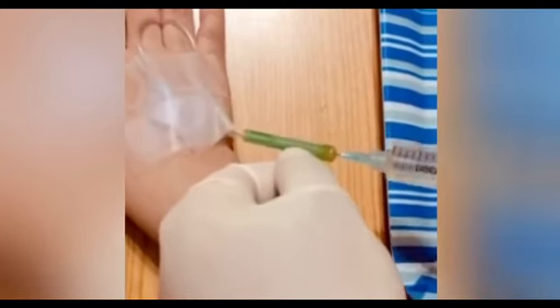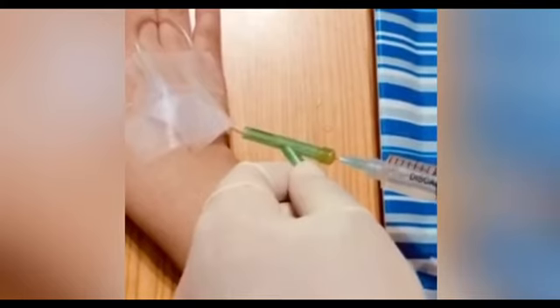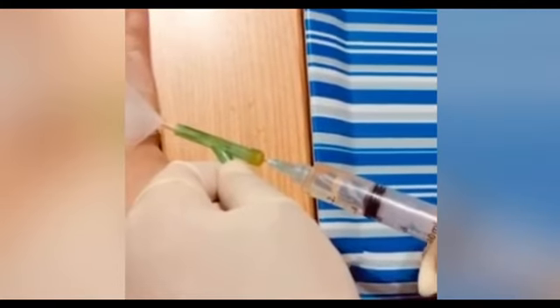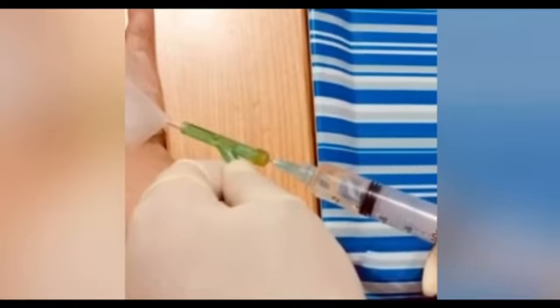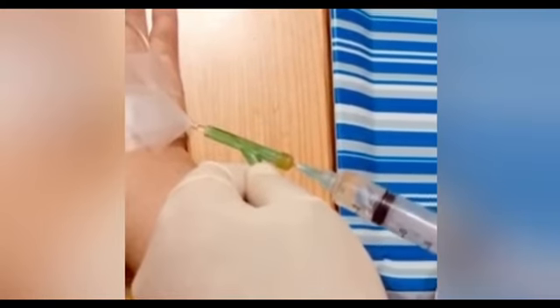So when flushing, we aspirate to check for backflow to make sure that the line is patent. And then we can proceed to slowly push to flush the line. If there is no resistance, it means that our line is patent. After flushing, we can then proceed to administer the medication.